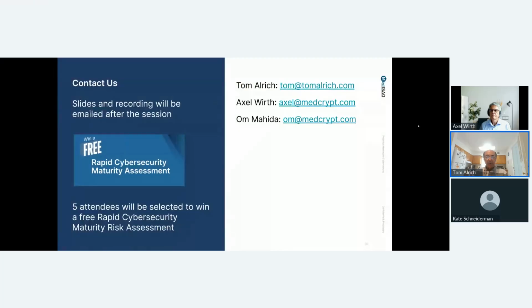Unfortunately, the problem with the NVD now is that you look in there for vulnerabilities for a particular device, and in almost every case it won't tell you about any vulnerabilities that were not in existence already by February this year. So you have to be very careful about using the NVD. It can't be used as, oh, well, things are great, I don't see any vulnerabilities here.